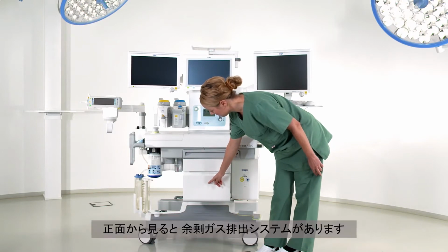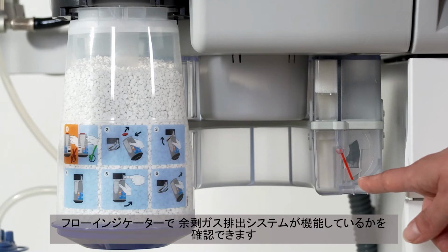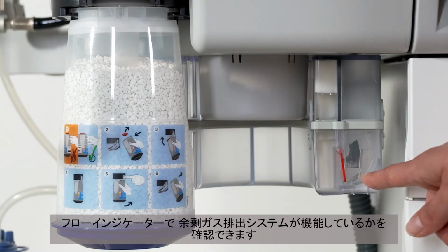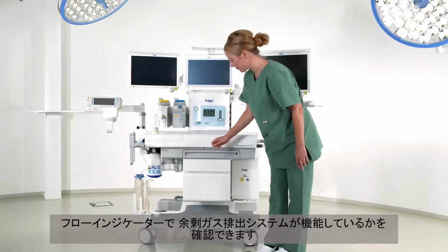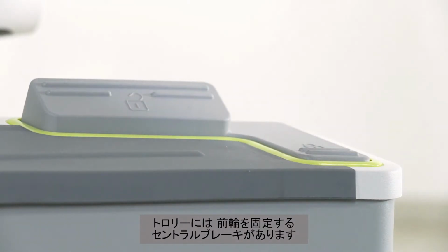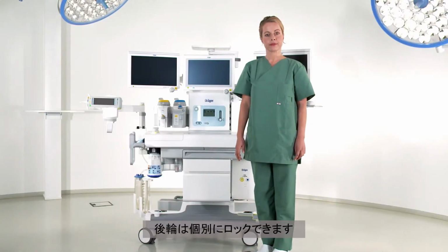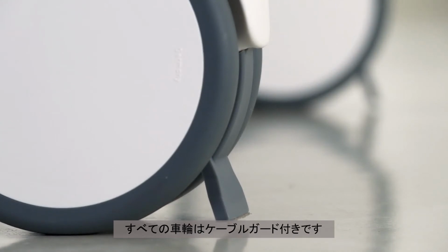From the front, you can see the anaesthetic gas scavenging system. The float allows you to see the functionality of the anaesthetic gas scavenging system. The trolley has a central brake which locks the front wheels. The rear wheels can be locked separately. All wheels are equipped with cable guards.